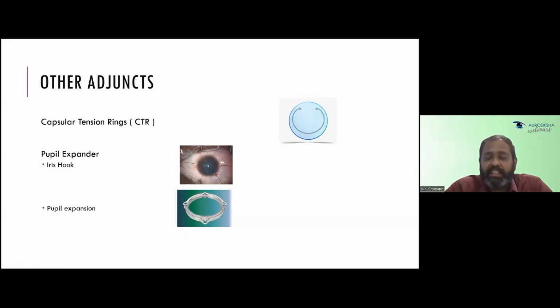This can increase the cost of the surgery for the patient by the cost of this device. Even in this, there are multiple types, such as the Cionni ring, which is a modification of this capsular tension ring.